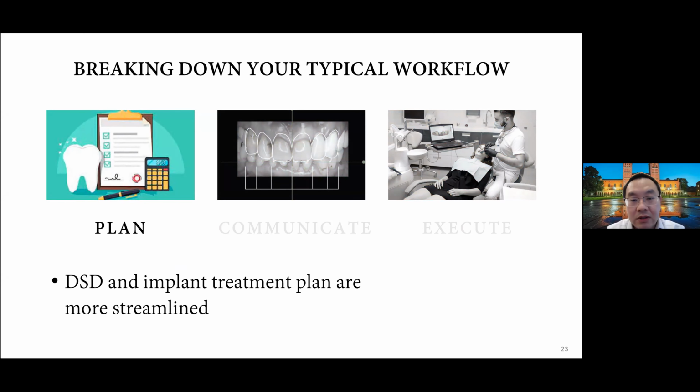If you have a digital workflow, how that helps you with treatment planning is that it's much more streamlined. You can just use a computer and show the patients in a much faster way how the treatment is going to be. You also have in your computer a lot of saved cases from other patients, without violating HIPAA, to show the patient other treatments instead of showing them a model, which is not necessarily the most visual, because to us it's second nature, but to the patient it's still kind of a foreign object, right?